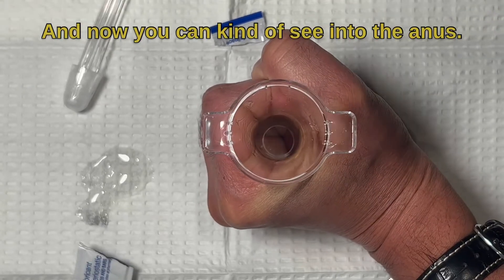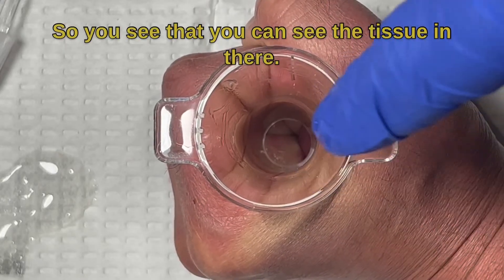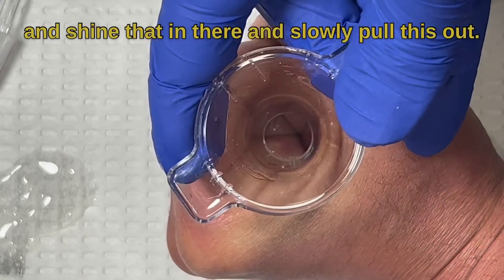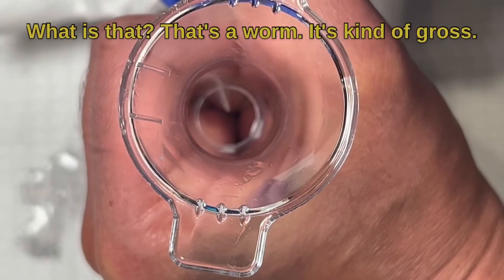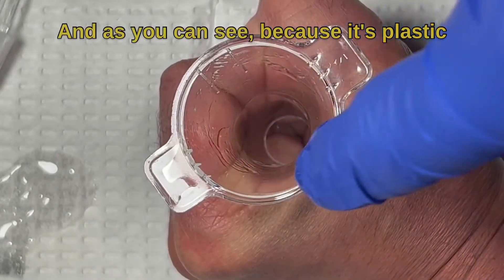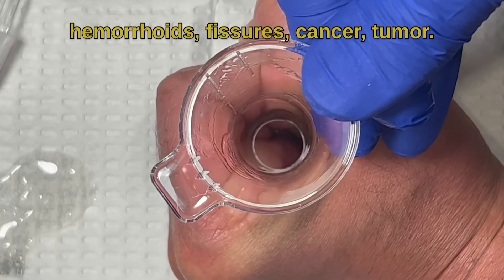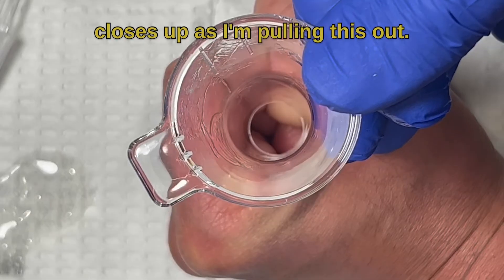Now you can kind of see into the anus — you can see the tissue in there. Most of us would have a pen light or use the light from the ophthalmoscope and shine that in there, and slowly pull this out. Oh — what is that? That's a worm, that's kind of gross, we're going to kill that later. As you can see, because it's plastic and clear, you can see the side walls of the rectum as you're pulling this out. You can look for hemorrhoids, fissures, cancer, or tumors. The skin closes up as you pull it out.